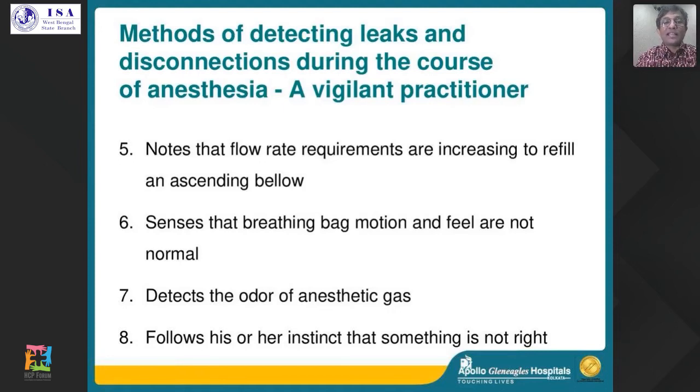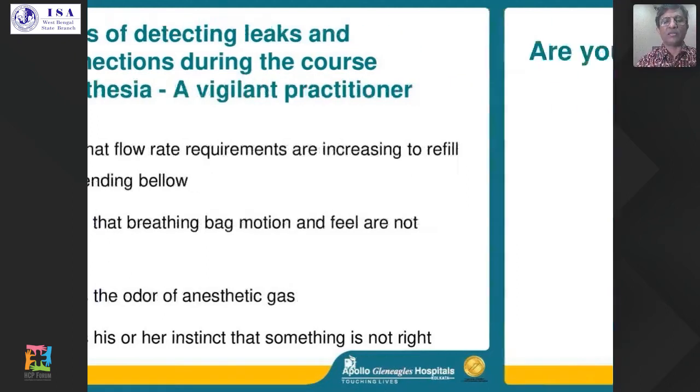Is the operating room smelling of anesthesia gases, which is again a classic sign that there is a leak somewhere. And ultimately it boils down to your instinct, your experience, and your vigilance about figuring out if something is not going right.